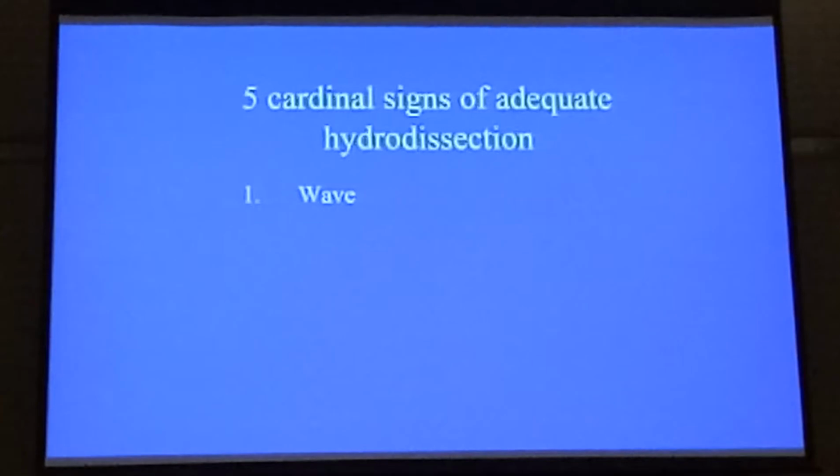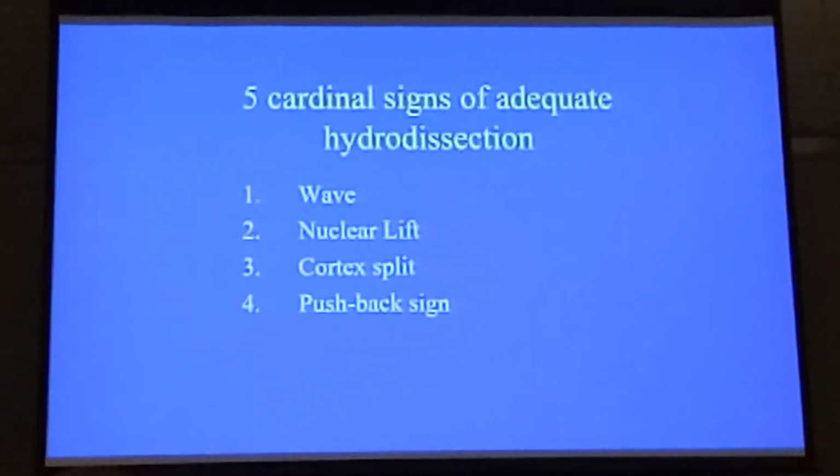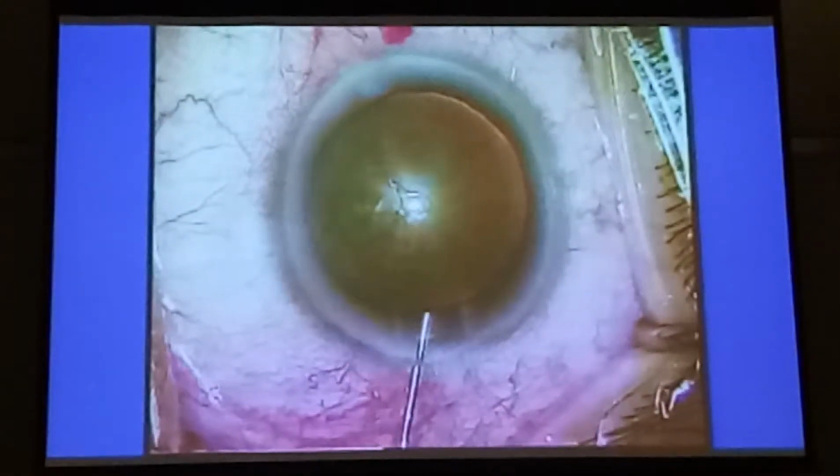If you see the wave, fine. But even if you see the wave, don't stop halfway. Some of my students are so happy they see the wave, they stop before the wave has gone to the other side. Then you still have incomplete hydrodissection. Make sure you complete it as I showed you. The nucleus lifting is very important. The cortex splitting helps you know that that is true. And if you want to confirm that the nucleus has come up, I always recommend you push it back and you'll see it pops back. And lastly, the nucleus prolapse. Normally, if you see even just 1 or 2 of these signs, that's enough to prove that you've got good hydrodissection.